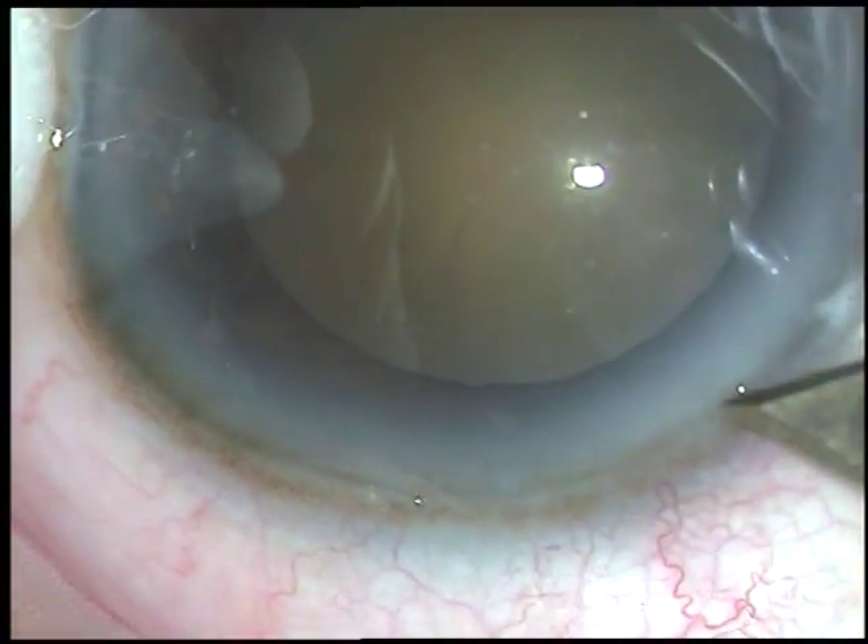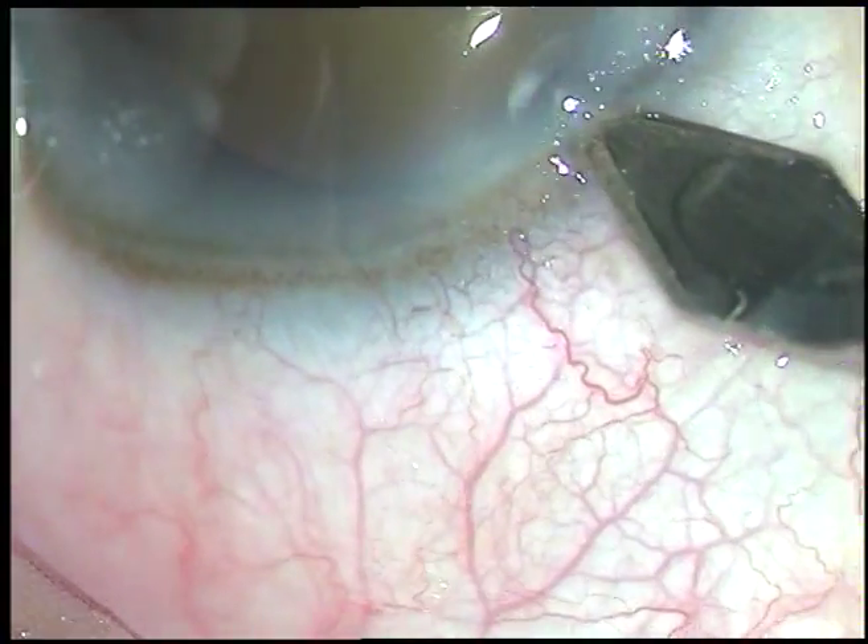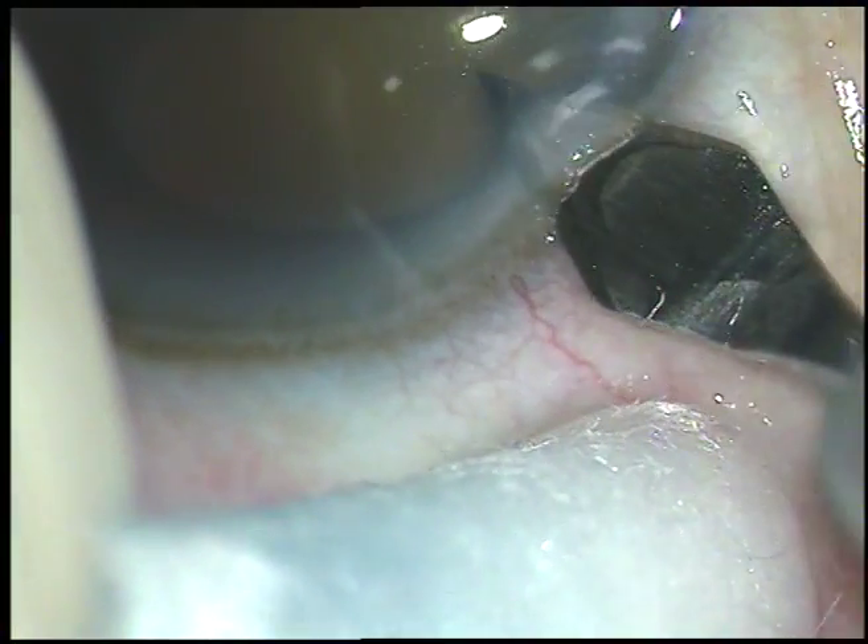Dear colleagues, this is phacoemulsification of a cataract with grade 3 nuclear sclerosis.